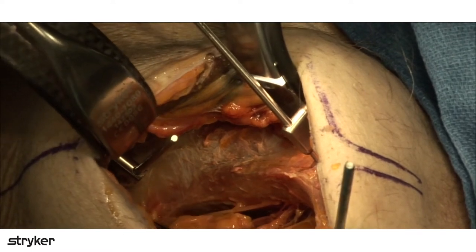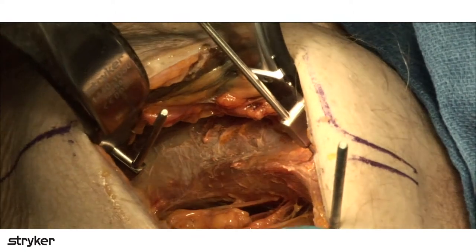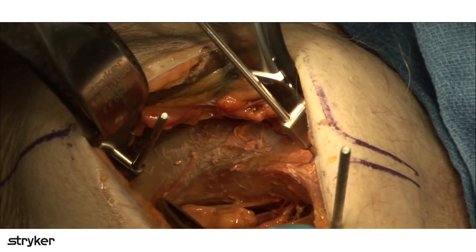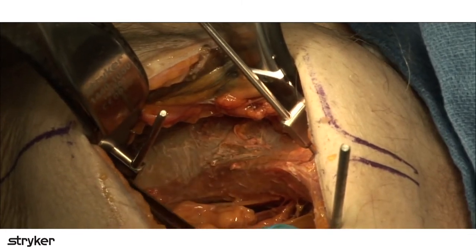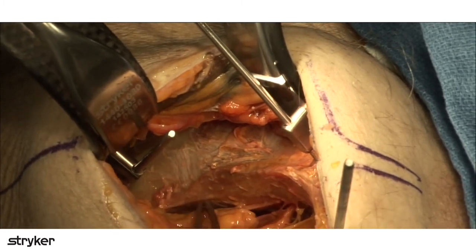And you can see right here, I'm lateral to the sacroiliac joint. That's the front lateral portion of the sacroiliac joint. So we see the brim from here all the way to the pubic body and pubic symphysis, right? So you can see how you can fairly easily get screws in for an anterior column plate, or anterior column buttress plate, or suprapectineal plate. You can see all the way back here from that.